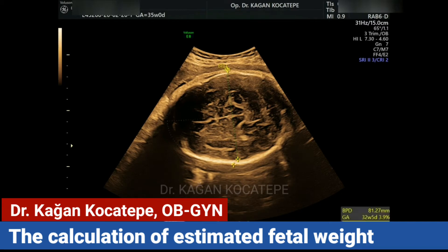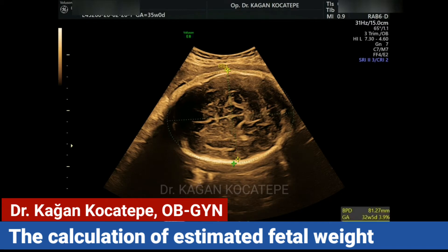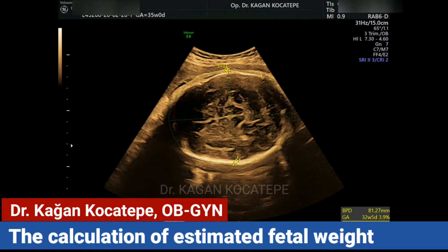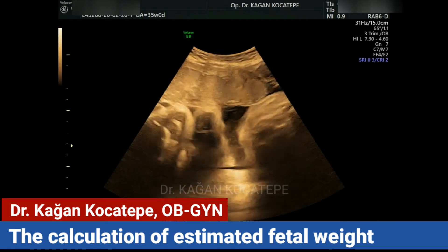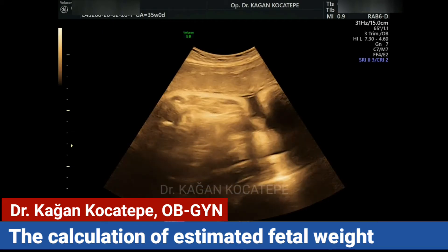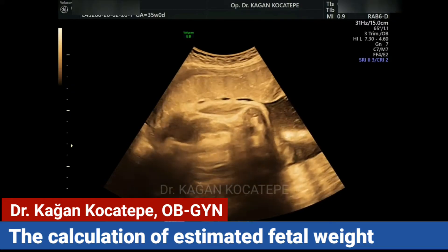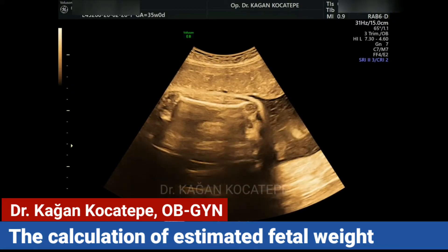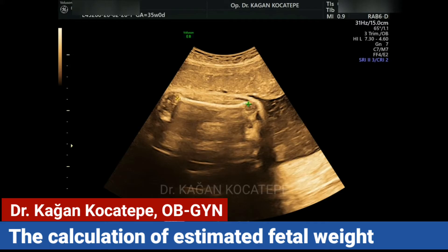The BPD and HC, which are the biparietal diameter and the head circumference of the baby's head, are measured here. The length of the femur is measured here, which is the upper leg bone — the FL measurement is made here.